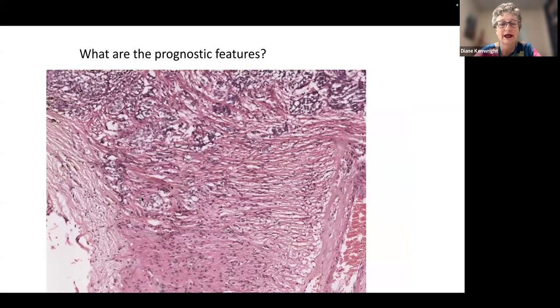If we look at it really closely, this confirms it. We can see here that the lamina, of course, has these horizontal collagen bundles, which is why it looks like that. And we can see the lamina ends here along with the tumor. Hang on. This might be a mixed one because there are some epithelioid cells. So we've got a mixed melanoma.